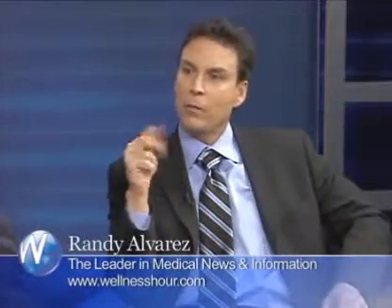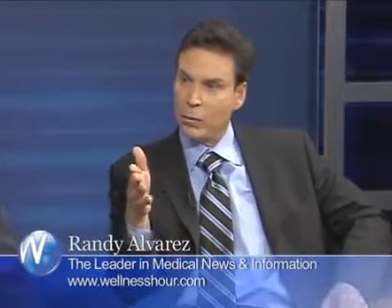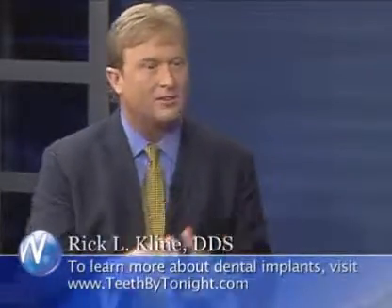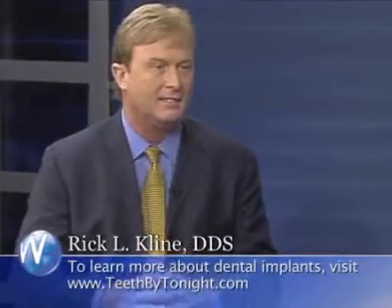Should a patient demand that from their dentist? I mean, if they're going to be doing dental implants, what do they say? Well, I think, in my opinion, that they should be using CAT scans. The difference is like driving your car with a blindfold on without the CAT scan. Okay. It's that different. I want to know all the details about that bone structure before we ever start the case. So the planning is critical in those cases.